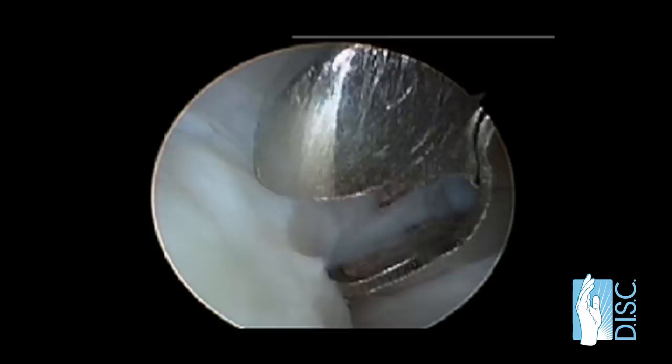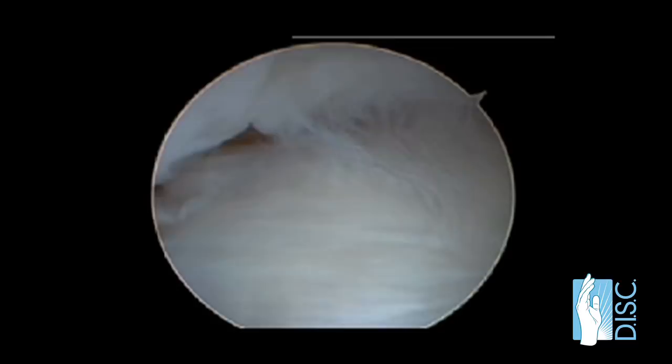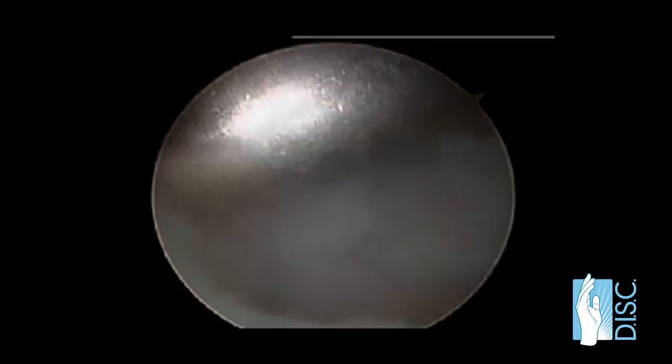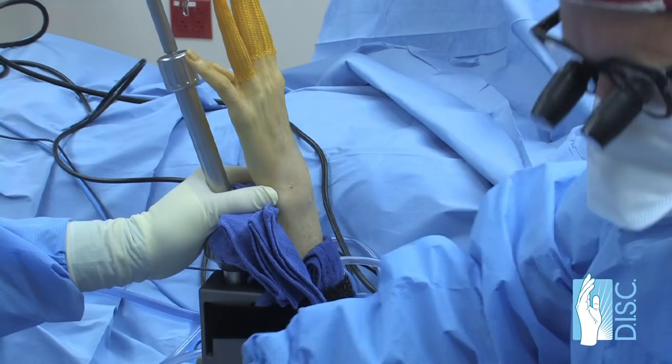It takes several attempts usually to get out all of the frayed pieces. That will be replaced now with the motorized shaving device that will suck the loose pieces as they are being trimmed out into the jaws of the shaver. You can see how this cleans up nicely. And then finally removing the scope and then closing the wounds.